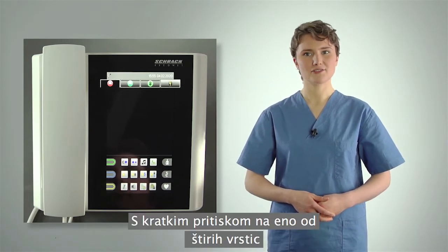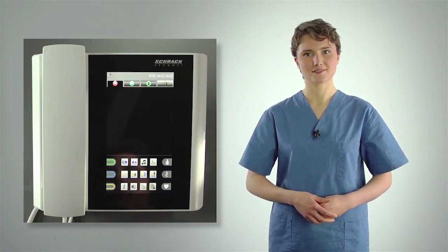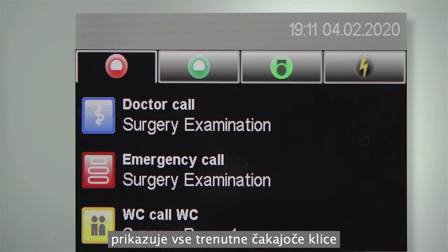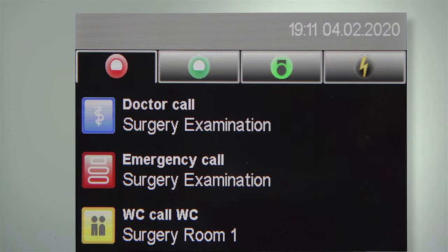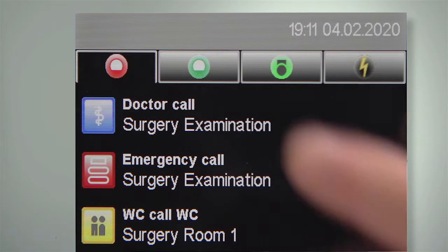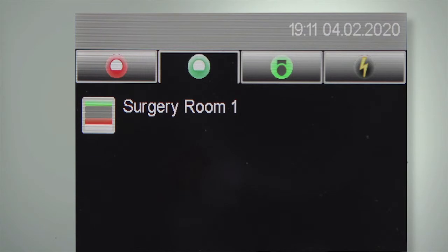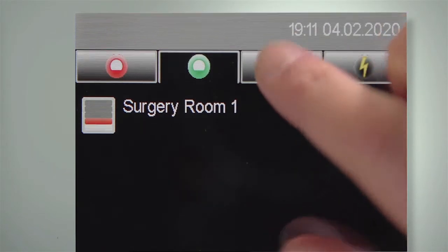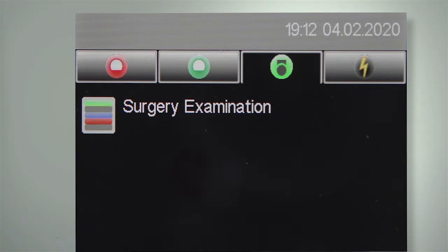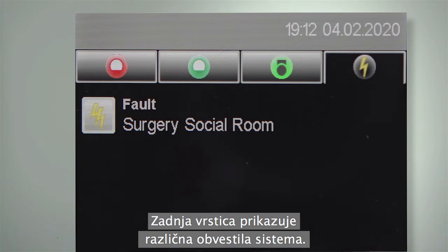Briefly pressing one of the four list tabs across the top opens the corresponding tab. The call list on the far left displays all current calls in order of priority. The most important current call is always at the top. Next to it is the tab for all rooms that currently have reminders. To the right is the tab for all rooms with set presences. The last tab displays various system messages.